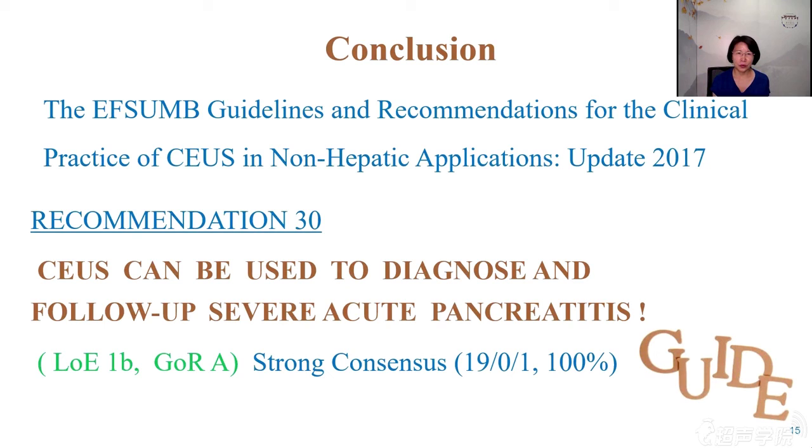At last, let's move to conclusion. The conclusion is just a recommendation of EFSUMB guideline. CEUS can be used to diagnose and follow up severe acute pancreatitis. To diagnose means CEUS can recognize SAP from AP. To follow up means CEUS can provide more information about local complication and the severity of acute pancreatitis.